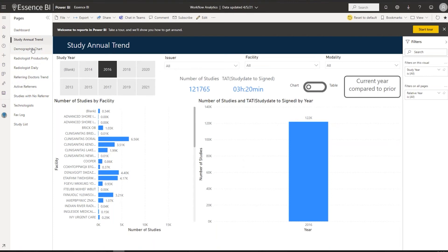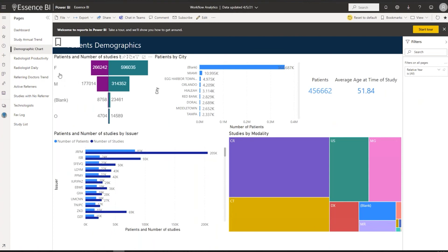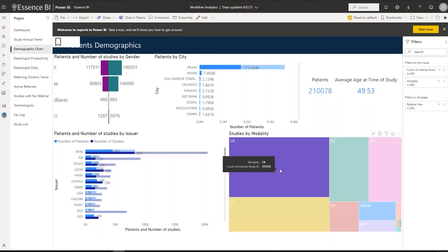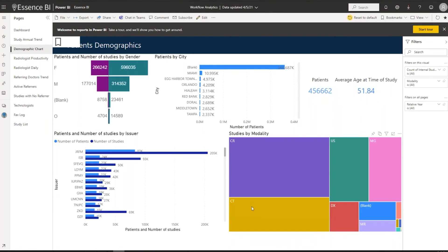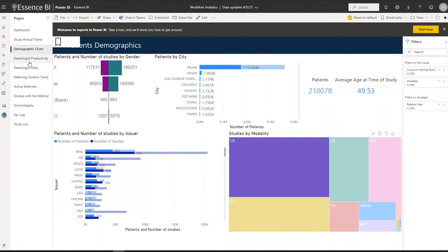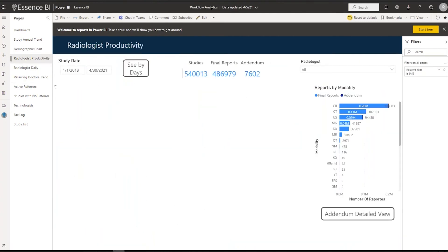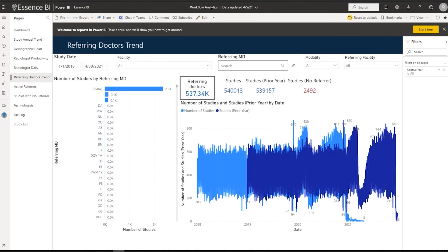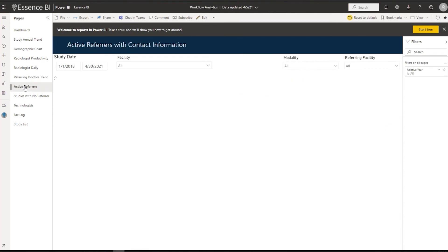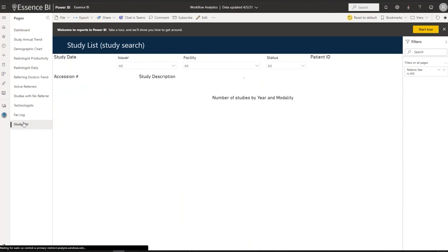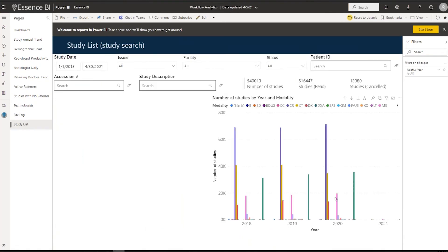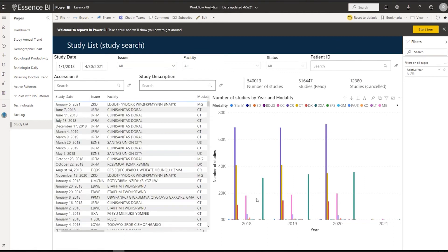Here's a study trend report — a year-over-year report so you can get trends for your facility. These trends can be on other metrics beyond what we're showing here. You can quickly compare years from one year to the next, or put them side by side. Here's a demographics chart showing the patient population based on male or female, patients by city, by modality, and so on — you could add zip code, refers, all those things. Here's a radiologist productivity chart and a doctor's daily trend by referring physician and active refers.